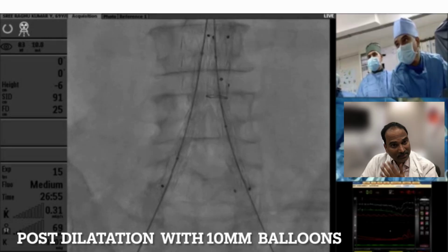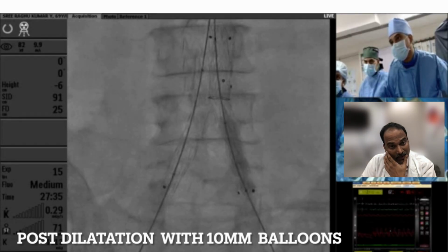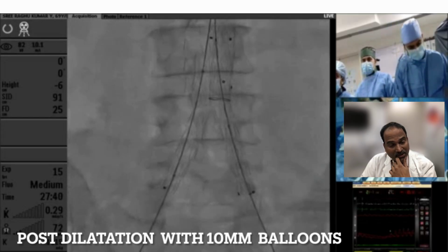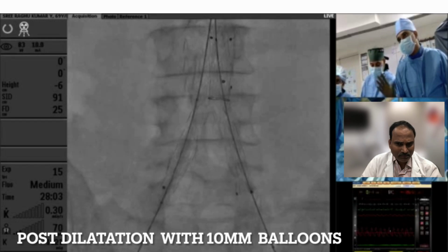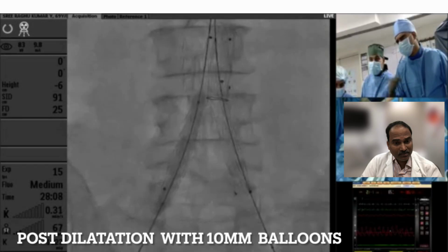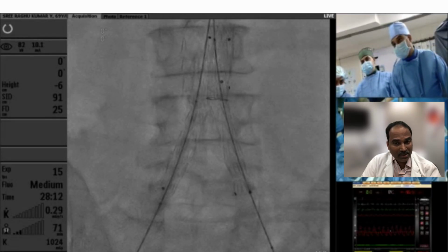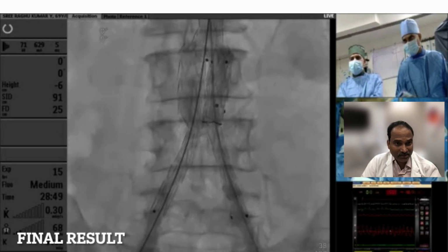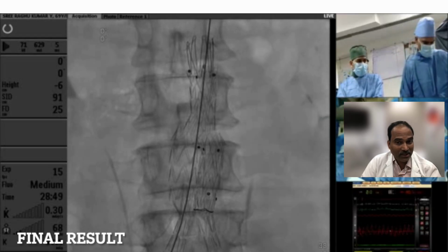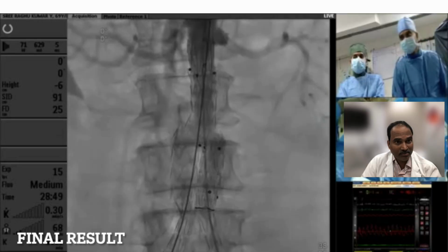Since we had an aneurysm extension up to the aortic bifurcation, we could easily handle the expansion of both iliac extensions. The aneurysm was stopping before the aortic bifurcation. That is when you have to go a little bit aggressively and dilate. Sometimes you can even create a rupture of the aorta. So that's when you have to rule out endoleak before going for aggressive balloon dilatation.